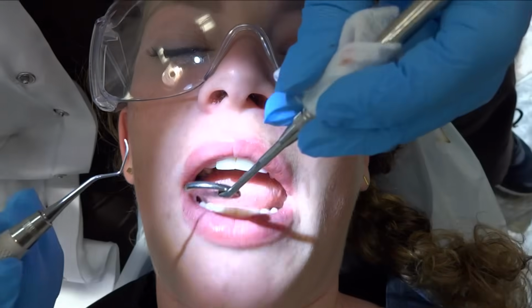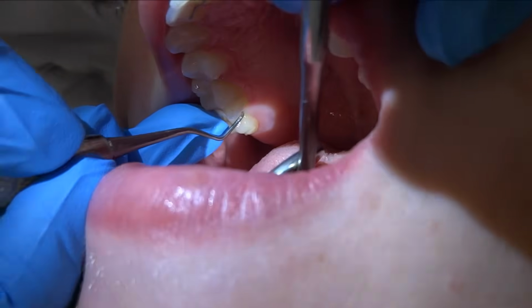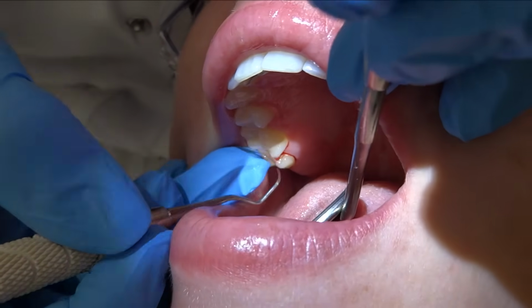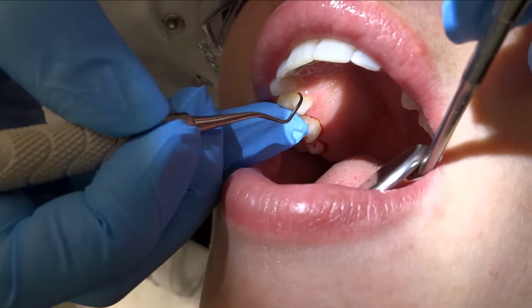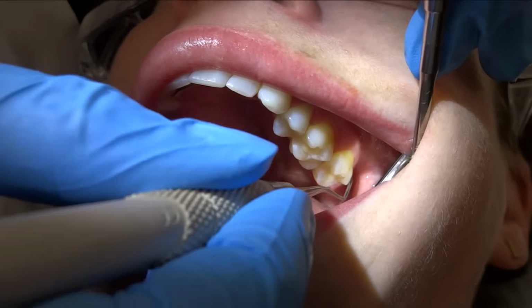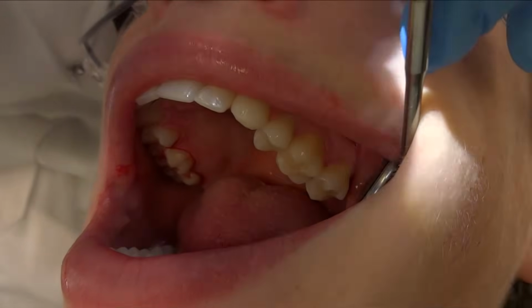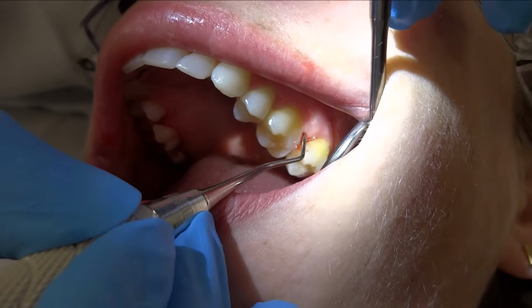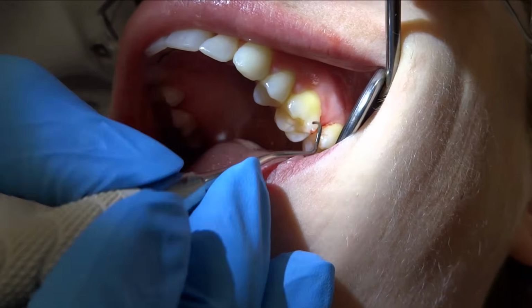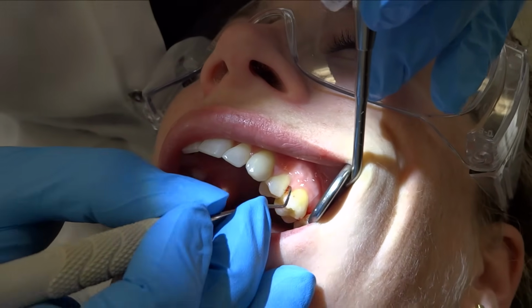Then I'll switch my instrument one last time to do the posterior teeth. Turn towards me just a little bit. Using that extraoral fulcrum and indirect vision to access this upper left area.